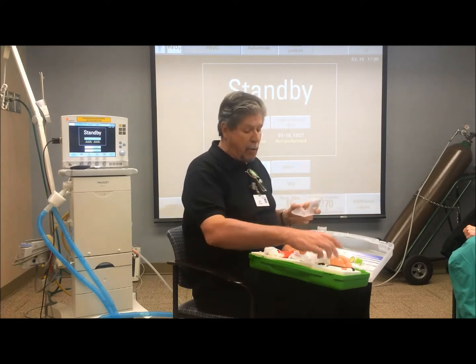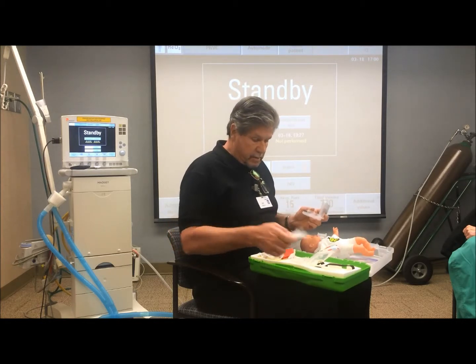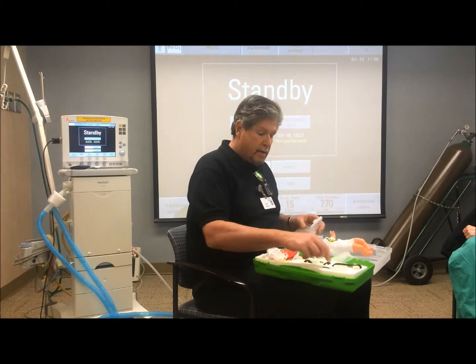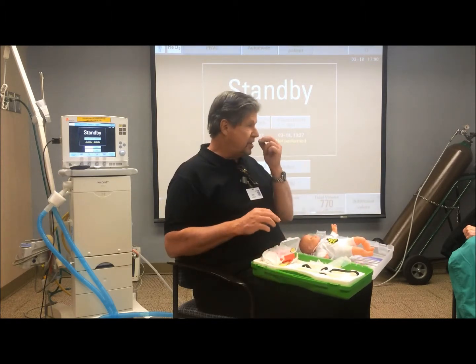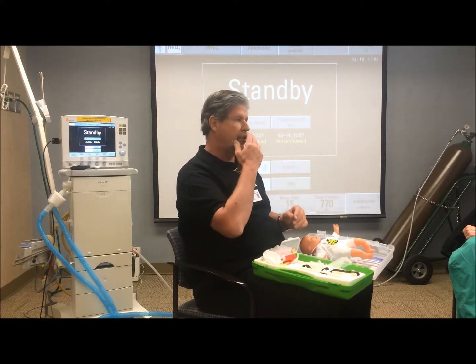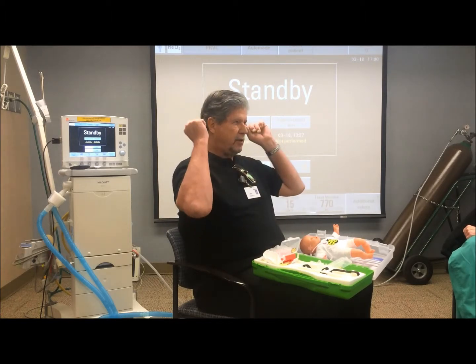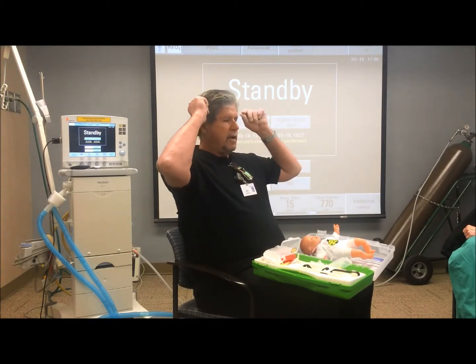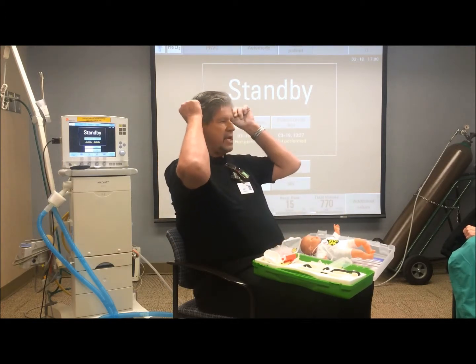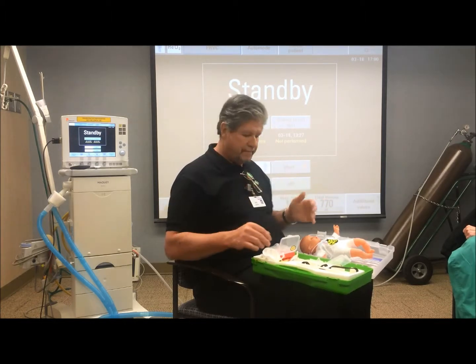And I will get you the PowerPoint for this, so that you can show it to other people that weren't here. But it also tells you, if you're using the prongs, make sure that you don't force them all the way in. If you're just using the mask, not an issue. And there are other little tips about making sure that the bonnet doesn't come down over the ears, it comes to the ears, so you're not squishing the ears.